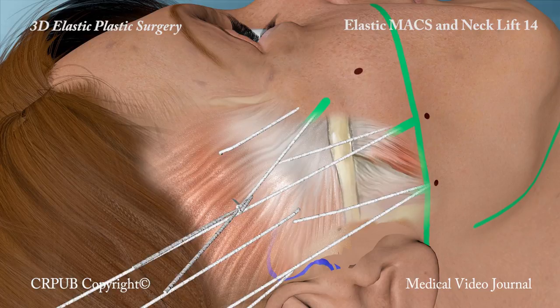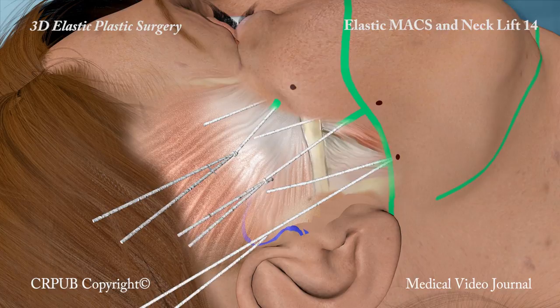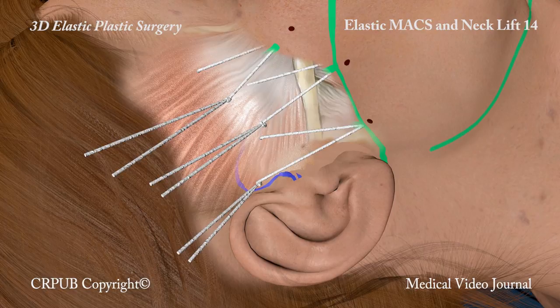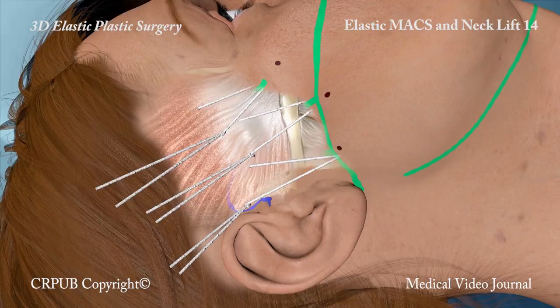The elastic threads are knotted. Within a short time, the thread will be colonized by connective cells, thereby becoming a ligament and making the result stable.